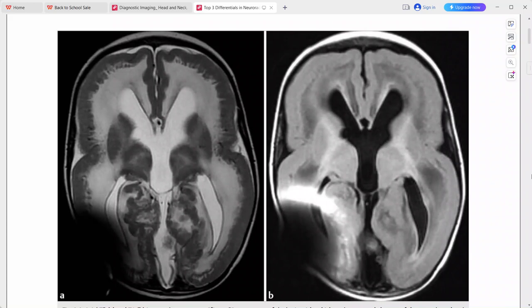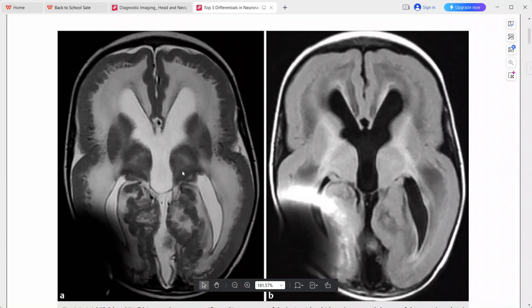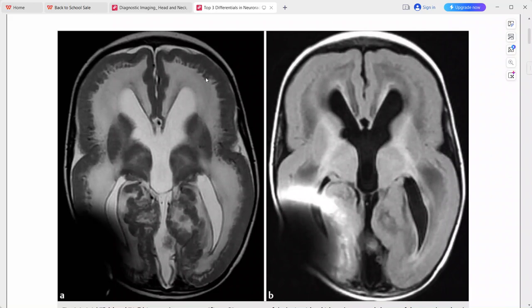This is the case of an infant boy brought with complaints of seizures, weakness, and failure to meet developmental milestones. On the T2-weighted axial MRI and T1-weighted MRI, there is a figure-of-eight appearance of the brain, a thickened cortex, and absence of normal gyral and sulcal pattern. The inner surface of the cortex has an irregular cobblestone appearance, and diffuse abnormal signal intensity is identified throughout the brain parenchyma.